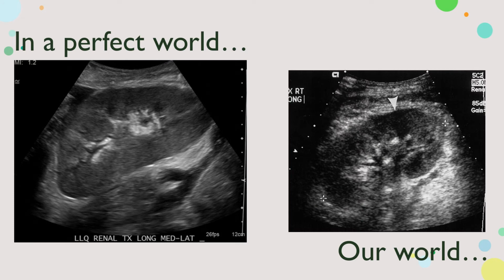Sometimes we get pictures like this. Hopefully they're not quite this bad, but they can be tough, right? It depends on the size of the patient, and will the machine allow us to drop our megahertz to penetrate, and other technical factors that go into it. So unfortunately, sometimes this is what we're dealing with.